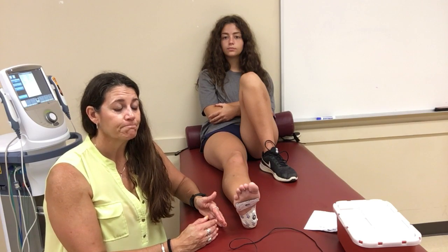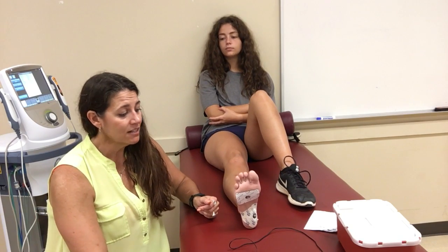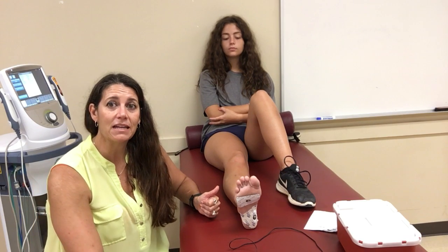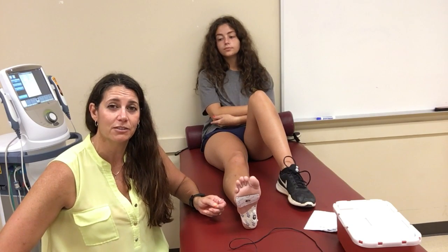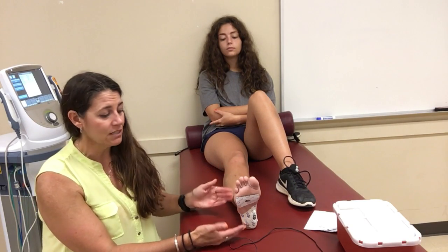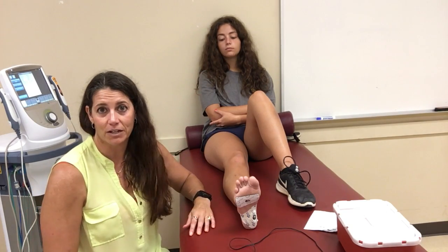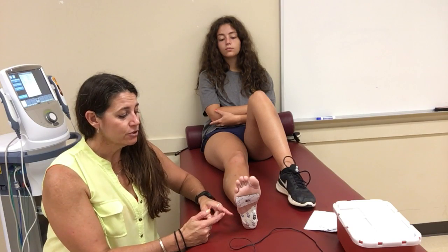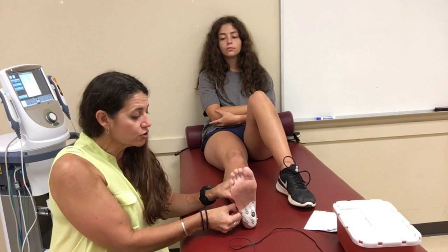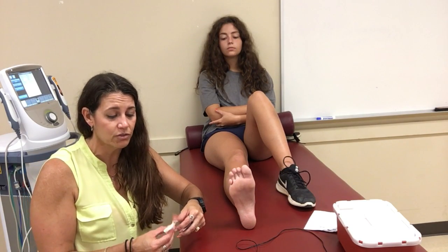You might do this a couple of times per week, but there are also limits on total treatments — generally around six in six months, though some places allow nine to twelve depending on state laws. The benefit of iontophoresis over oral medication like ibuprofen is that the drug goes directly into the target body part rather than being swallowed and dispersed everywhere, so you see much more direct, localized effects.